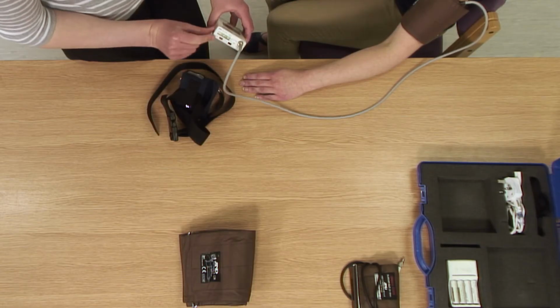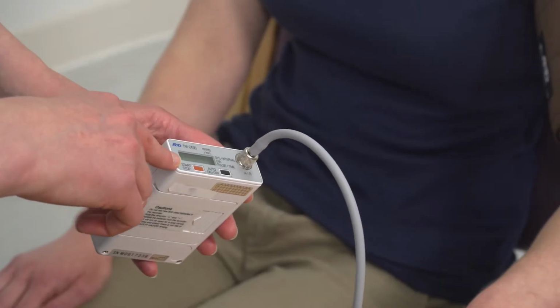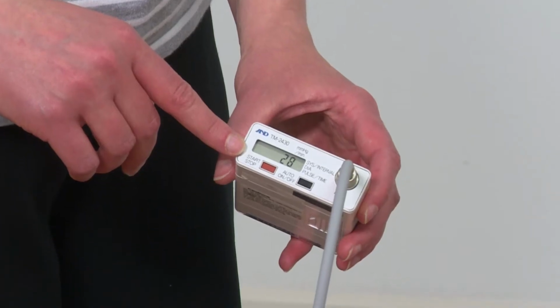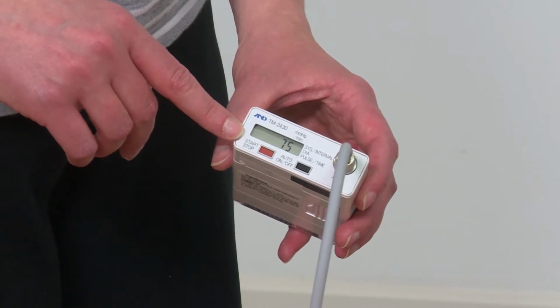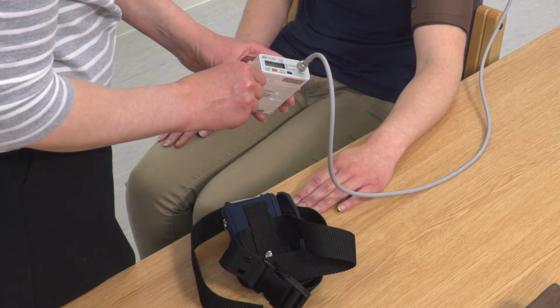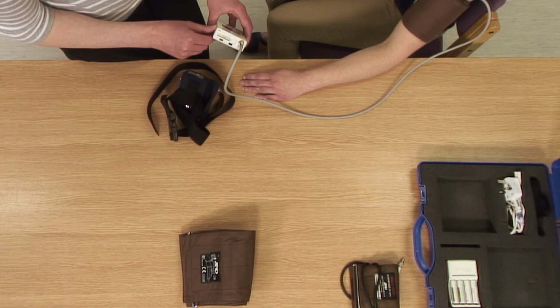Take a test reading. Press and briefly hold the red Start-Stop button once. Ensure the patient is seated with legs uncrossed, relaxed and remains quiet and still while taking the measurement. The cuff will inflate to an initial pressure of about 185 mm of mercury. It may inflate further if the blood pressure has not been detected or during movement or arrhythmia. The average time taken is 20 to 30 seconds. The maximum measurement time is 90 seconds.